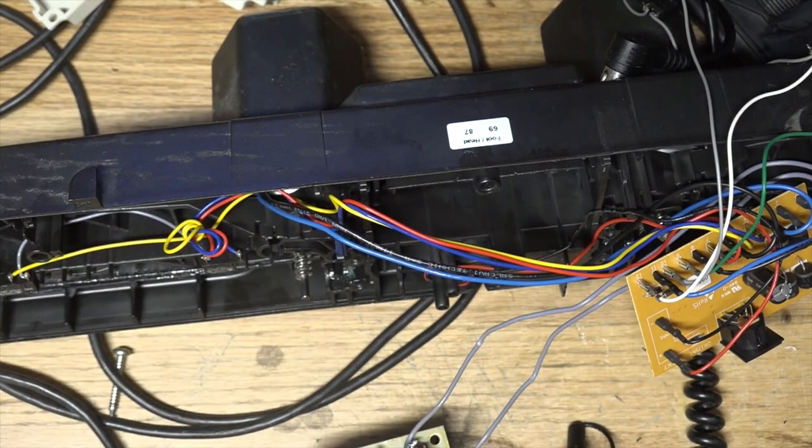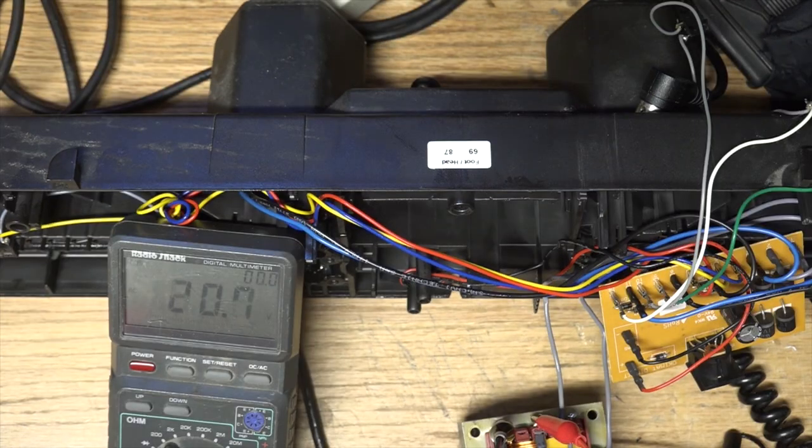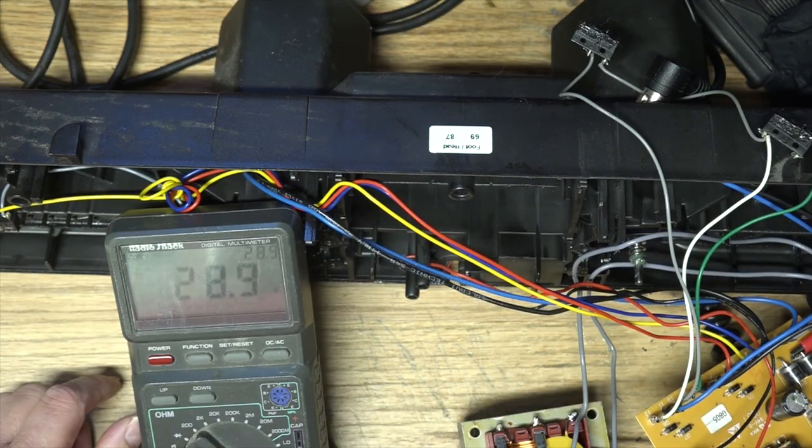My question is, what is the voltage? Let's get a voltmeter. Oh yeah, I gotta put it on AC, stupid. 21 volts coming out of there. It's being full wave rectified and then filtered, so that's gonna be 21 volts times 1.4, about 30 volts.